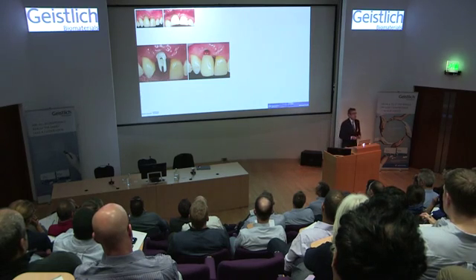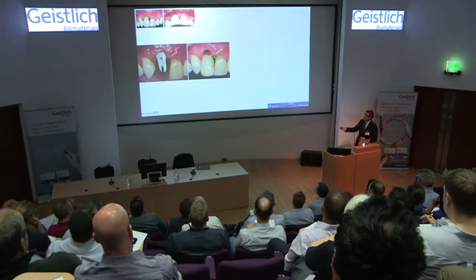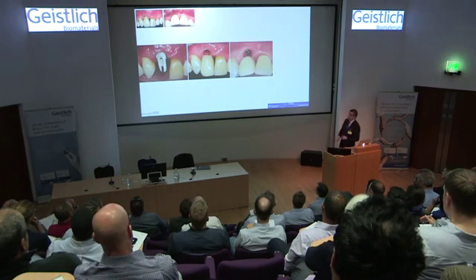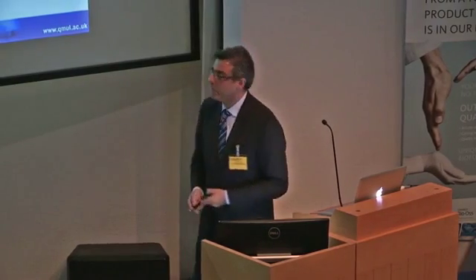And this was an opportunity to try and assess and analyze with the patient if the patient would be happy with that outcome. And he said that would work, accepting the black triangle here, but trying to get everything else correct. And that is achievable. That is what we can do. But look where the restoration needs to be and where the implant is. And that is the primary problem in this case.